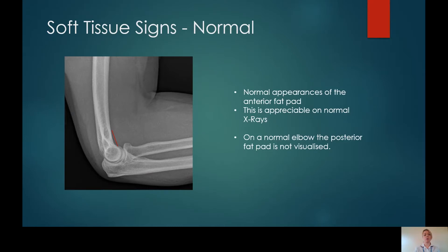This is an example of the normal appearances of the anterior fat pad. It is normal to be able to appreciate this on a lateral elbow and is not indicative of a fracture. It can be more prominent on some people compared to others — however, that's normal for them. It is never normal to see the posterior fat pad, and if you can see this, this is indicative of a fracture.